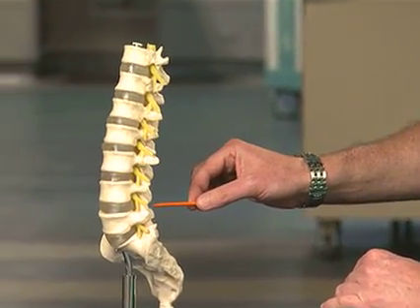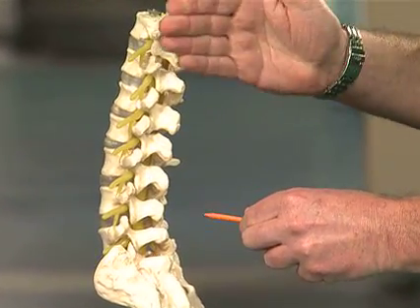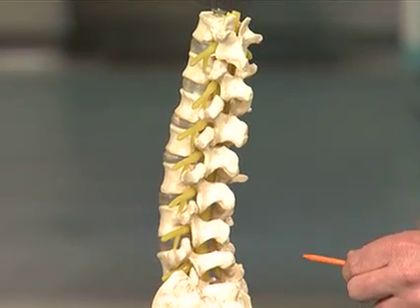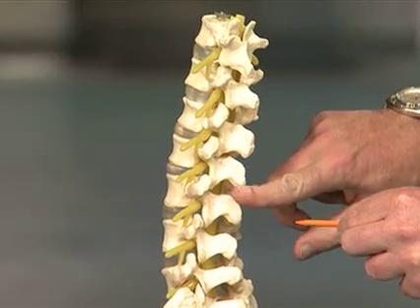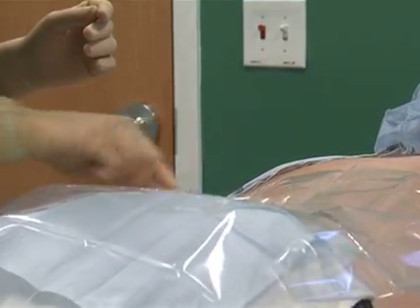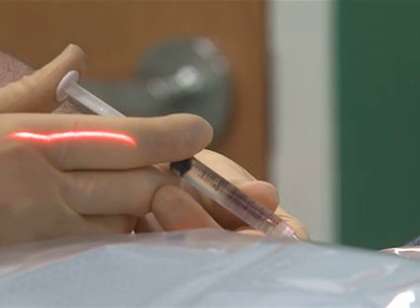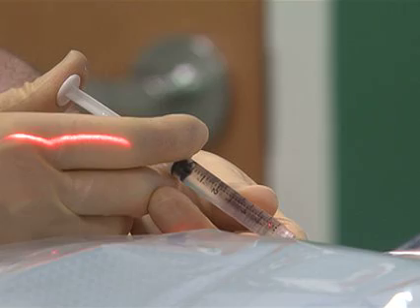directions. We can do a midline approach, and we're looking at the back part of the spine, and this is where the skin is. If you feel along the midline of your spine, a lot of people can actually feel these structures called spinous processes. After we prep and clean the skin, we place some local anesthetic in the skin. It's usually very well tolerated.